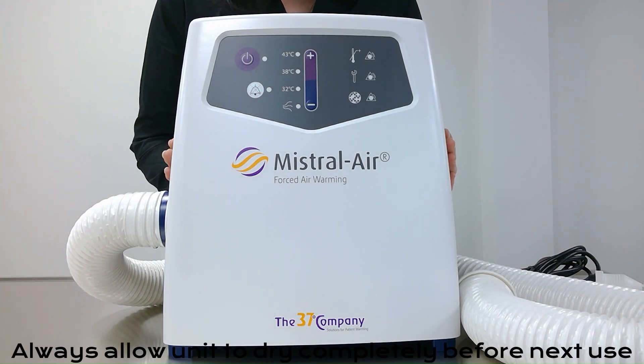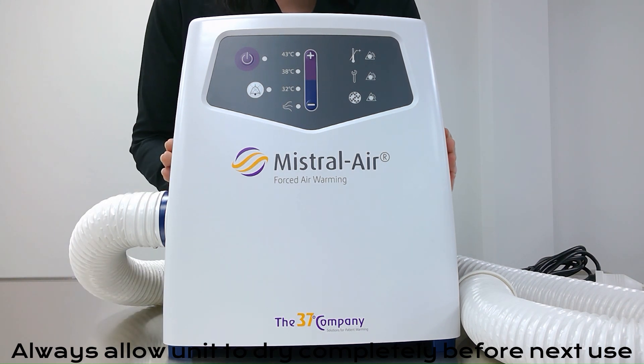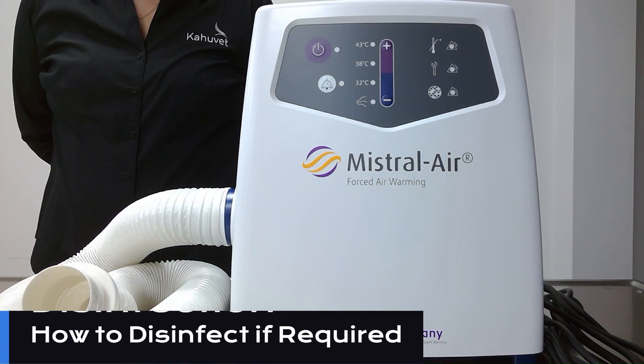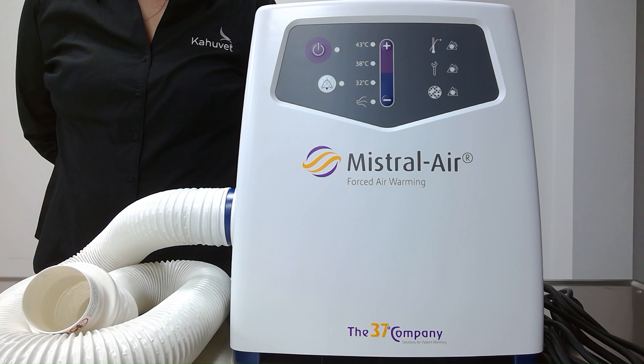Always allow the unit to completely air dry, including the hose, before putting this back into operation. If disinfection of your unit is required, we can use isopropyl alcohol on a lint-free cloth, making sure that this is only slightly dampened to avoid any excess alcohol going into our unit. Again, allow the unit to air dry before putting back into use.